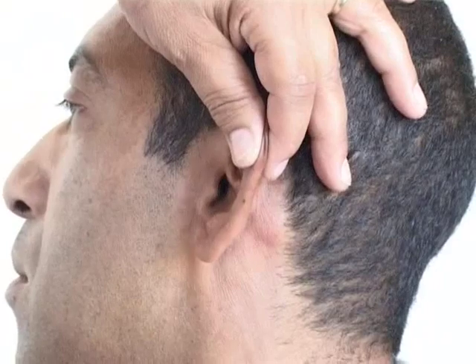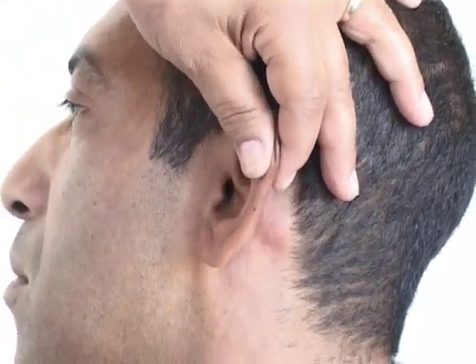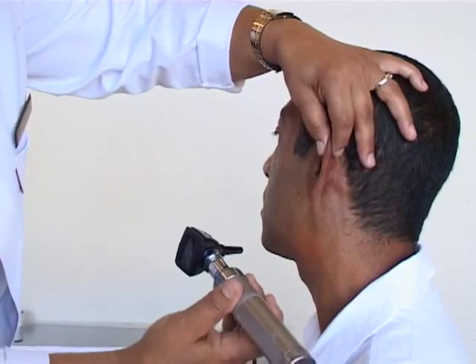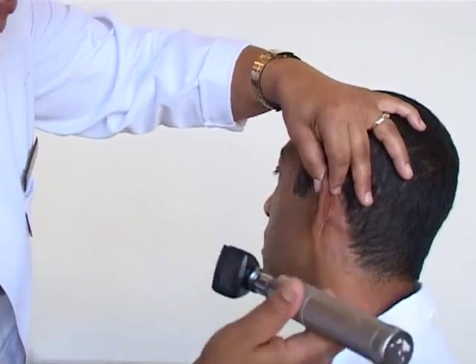But now, if we go in with the otoscope to examine the external auditory canal and the tympanic membrane, there are normal features that we must look at. Okay? We said we're going to pull the ear up and back for the adult, and while we're doing that, we're straightening the ear canal so that we can focus on the tympanic membrane.